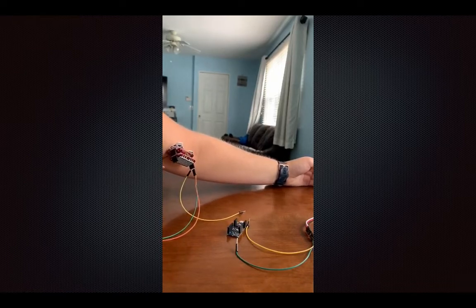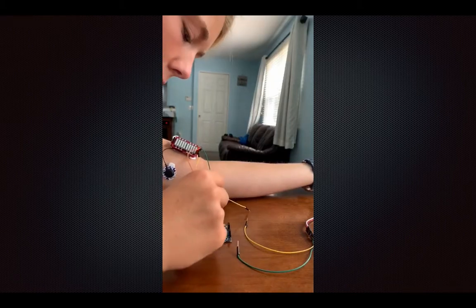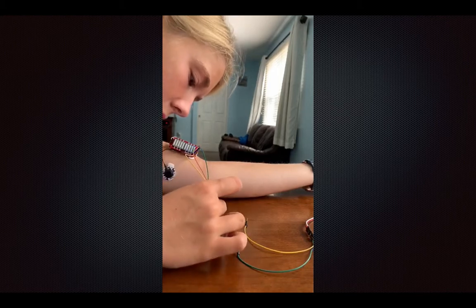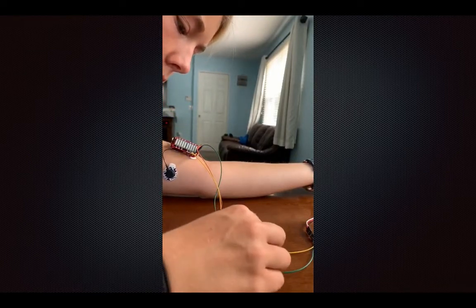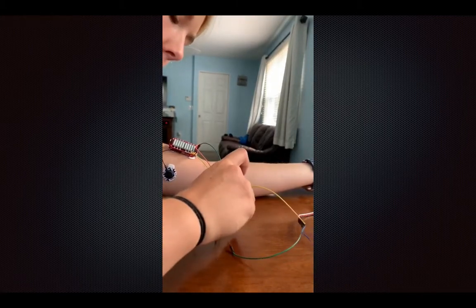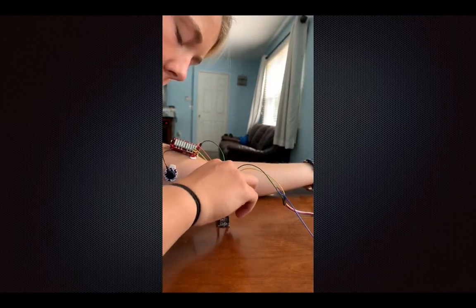So now we'll connect the wires to the Arduino Nano board, and you attach them based on what are inputs, outputs, and certain grounds. The Arduino Nano board that I'm connecting the wires to had been pre-coded so that it would transfer the message from the muscle sensor to the motor. And basically I'm attaching the wires to certain grounds, inputs, and outputs so that it produces the message to help the motor move once the muscle is flexed.